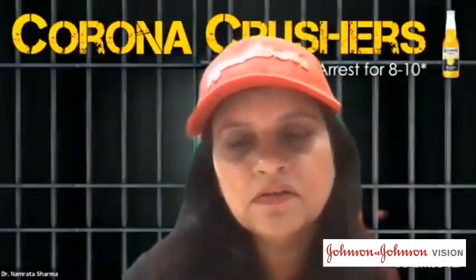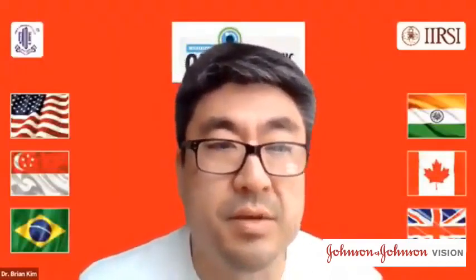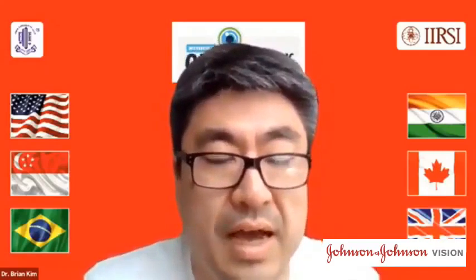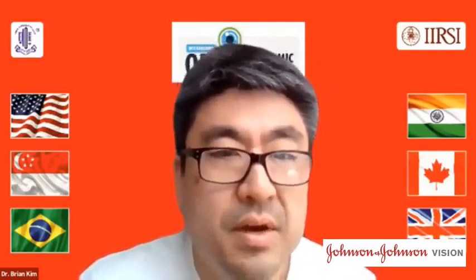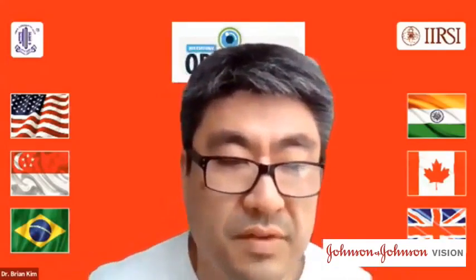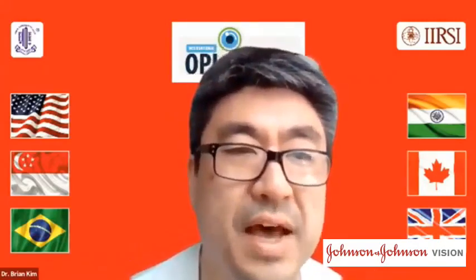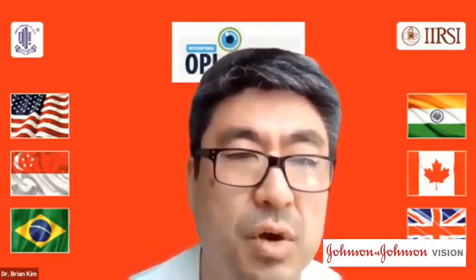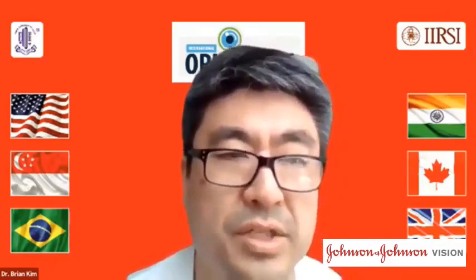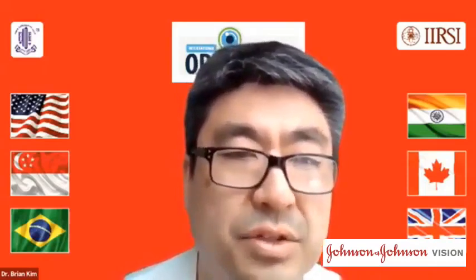Thank you. So I think first of all, the techniques are excellent. The glued technique, the Yamane, and using Gore-Tex suture to fixate to the sclera, I think they're all excellent and they have their place. With regard to the Yamane, Dr. Yamane's device is excellent, but I don't believe you can adjust for corneal size with that ring that he developed. And so I worry about the distance from the limbus posterior. I go about 2.5 millimeters back. And so with that device, there's no way to adjust for that. And so that's my main concern.